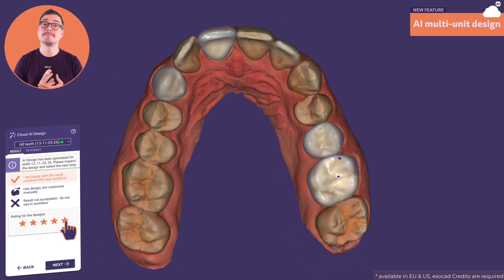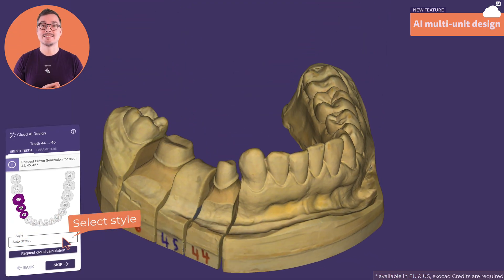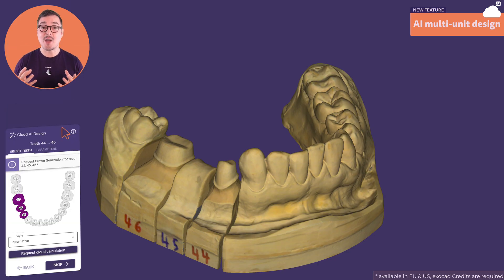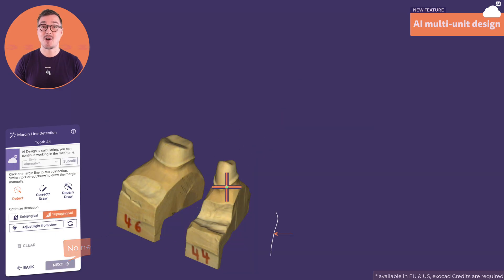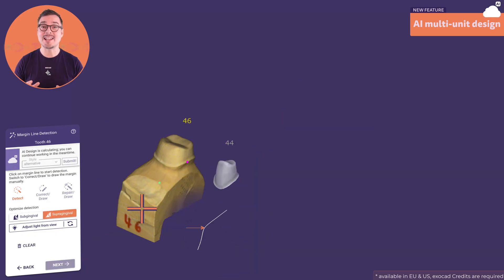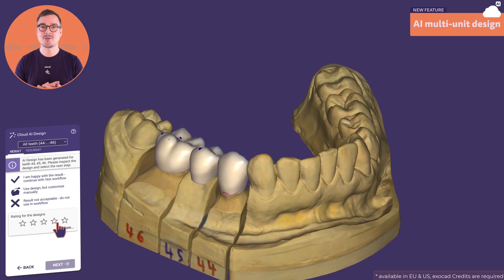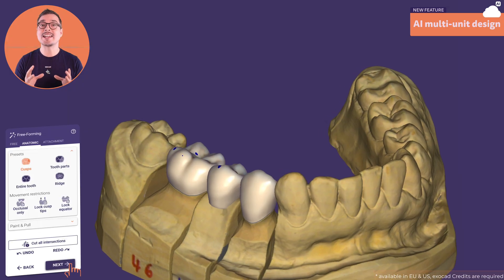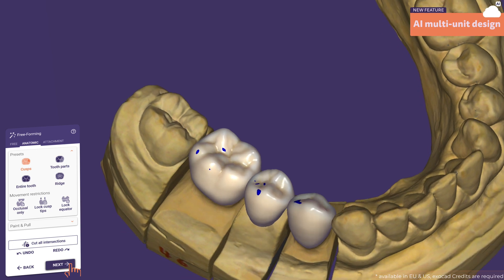Three-unit bridges are already possible with AI, and you can select your preferred library to be considered. You don't need to wait for the calculation — just continue the case and start detecting margin lines and crown bottoms in the meantime. Because it is integrated seamlessly into your workflow, you can use the full range of ExelCAD's editing tools with no retraining needed.